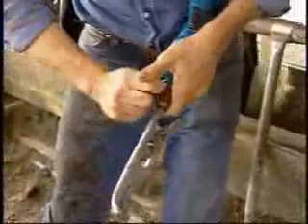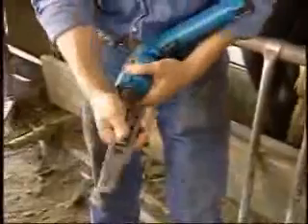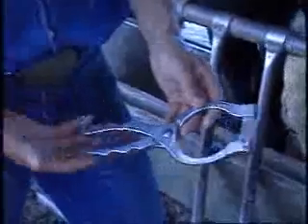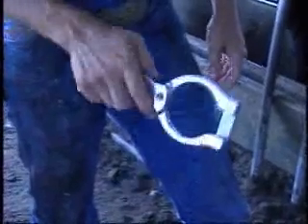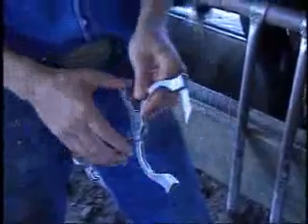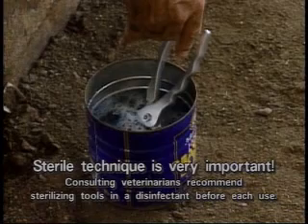It is essential that only a variable speed drill be used and that the castrating instrument be tight and secure in the drill chuck. It is also preferable to use a Newberry-style knife to open the scrotum or sac, since this type of knife has been demonstrated to make the type of cut that improves drainage and reduces swelling and localized trauma following castration. Sterilization of both the instruments and the animal's sac is important.